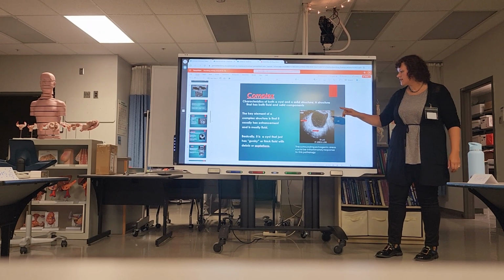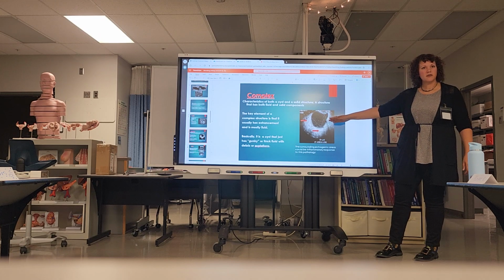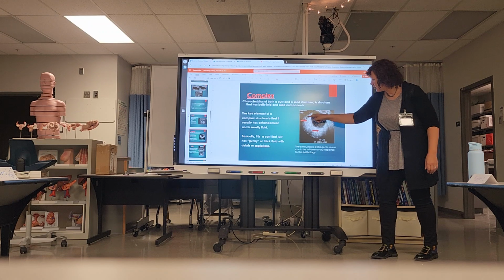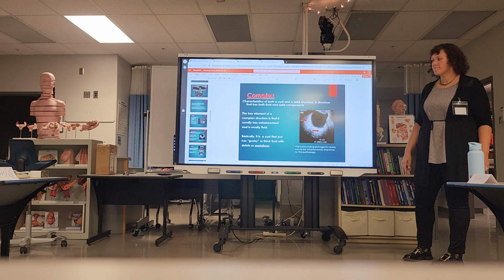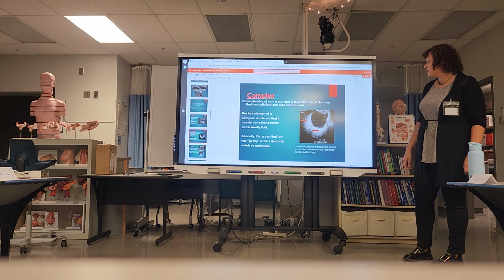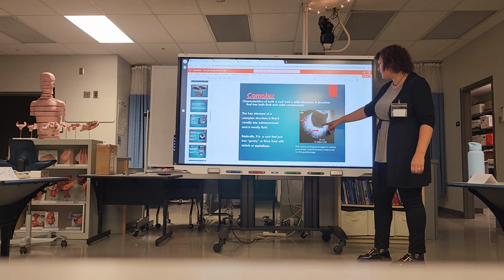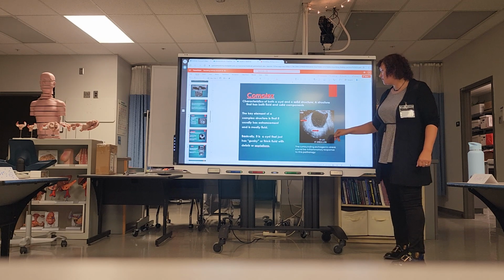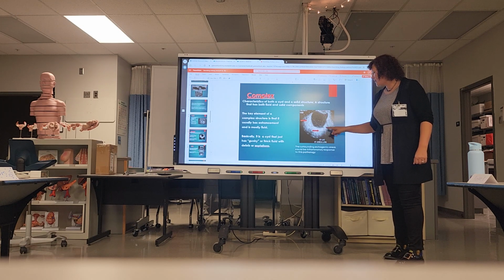All right. So now it's no longer a simple cyst. It is complex. And then we can see all this enhancement posterior to it. Y'all see that? So it's inflammation around it. No. This is just enhancement. What do I say about inflammation? Underneath it says the surrounding echogenic areas can be inflammatory response. Okay, so could be, yes. But this is enhancement. This is way too bright to be inflammation.